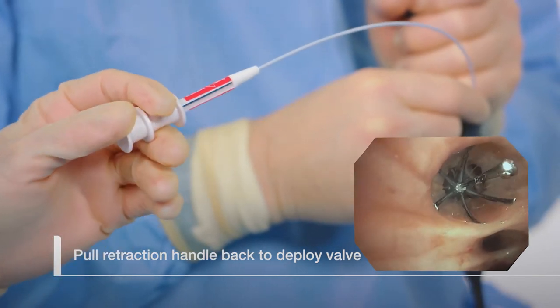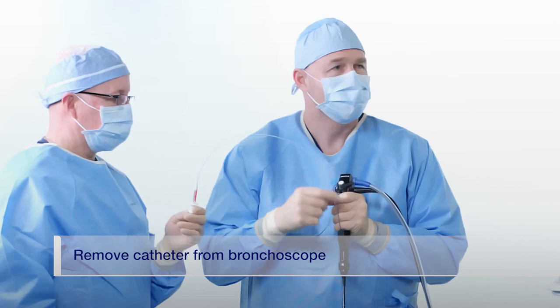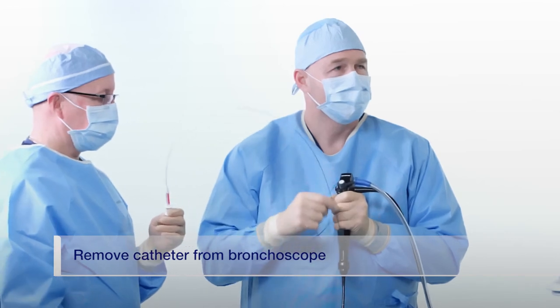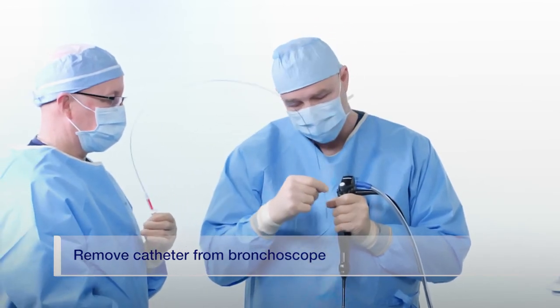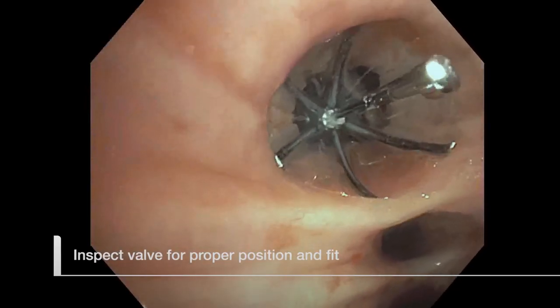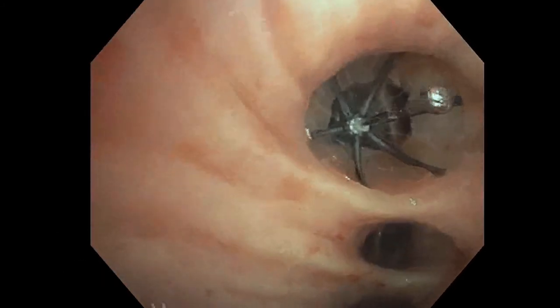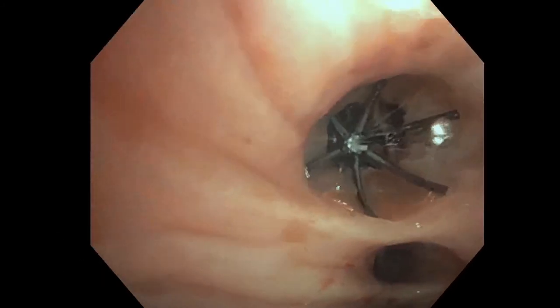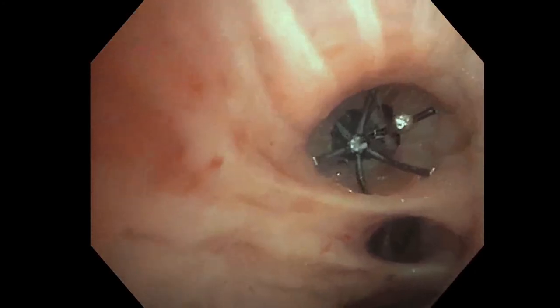Once the valve is completely deployed, immediately remove the catheter from the bronchoscope. Visually examine the valve for position and fit. The valve should be opened and opposing against all borders of the airway.